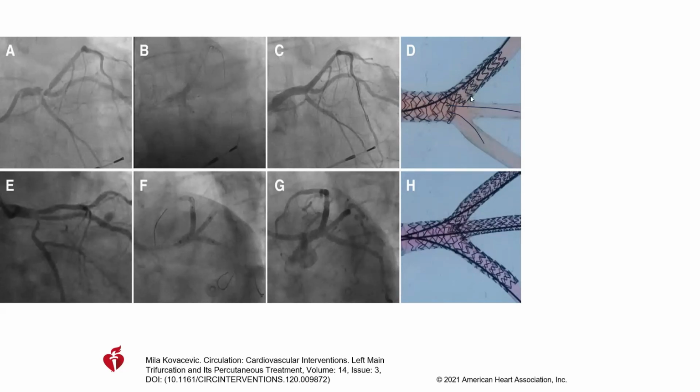So they stented from left main to LAD. They did a good POT that opened up those left main struts into the branches. Then they rewired those branches through the distal struts close to the carina. That relatively distal strut rewiring will eventually reduce stent protrusion and overlap in the main vessel.